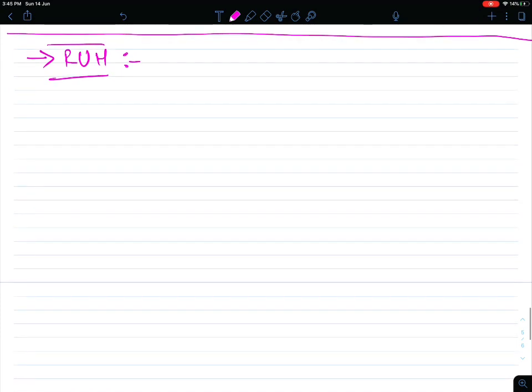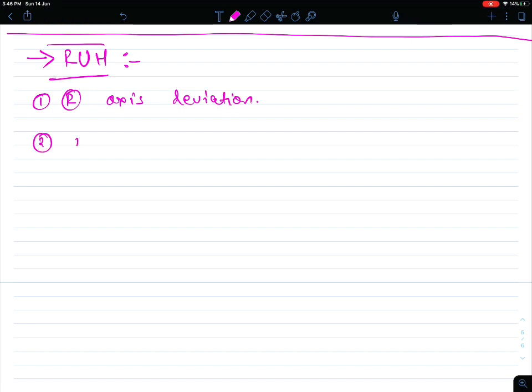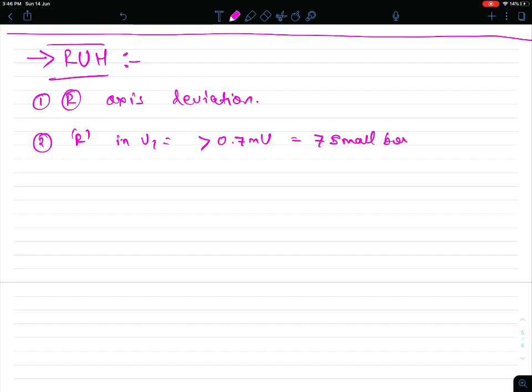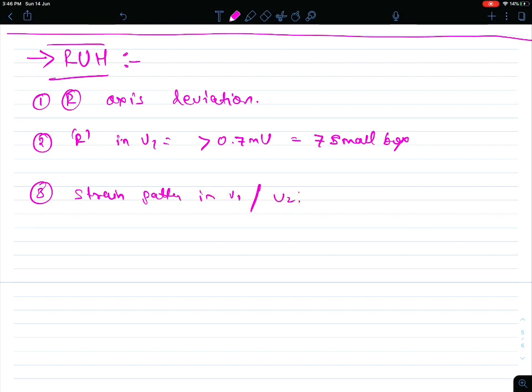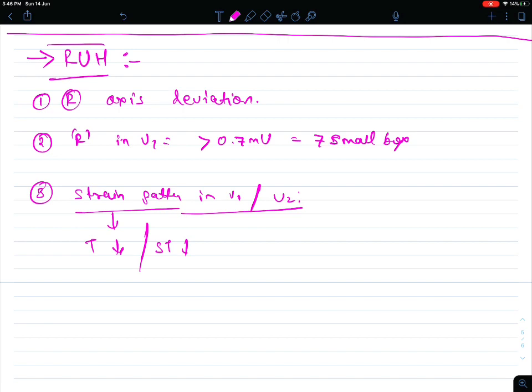Let's come to diagnostic criteria for right ventricular hypertrophy. The changes which suggest right ventricular hypertrophy are: first, there should be right axis deviation. Second, R wave in V1 should be more than 0.7 millivolts or more than 7 small boxes. Third, there should be a strain pattern in V1 and V2, meaning T wave inversion or ST depression.